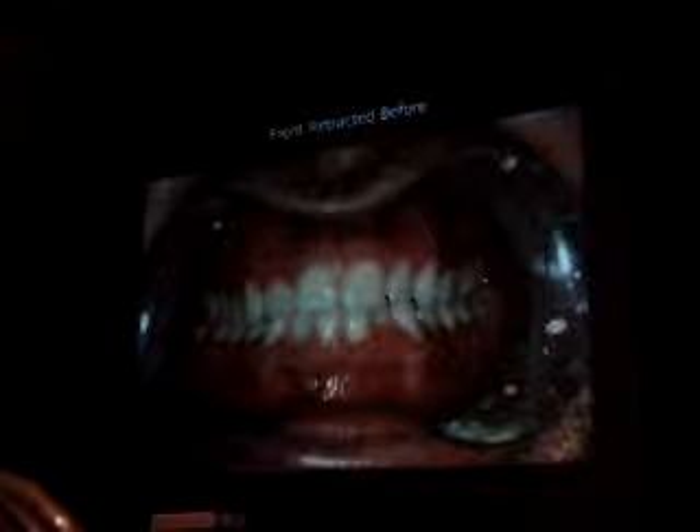So let's go ahead — that's his before. And we'll go ahead and get his close-up. If you can adjust the camera to pick up — just like that. Touch your chin down, open just a little bit, open just a little bit there. And this is what he's got.